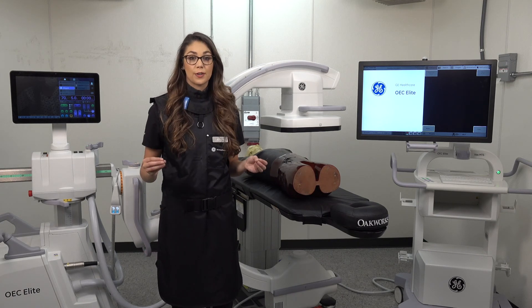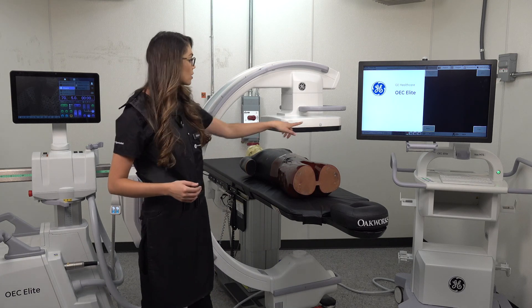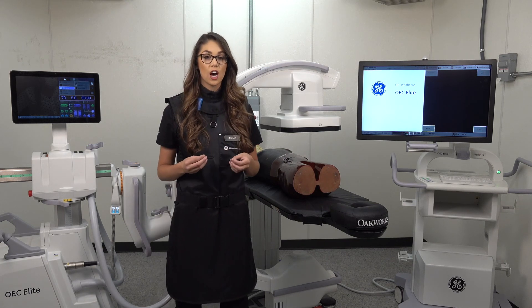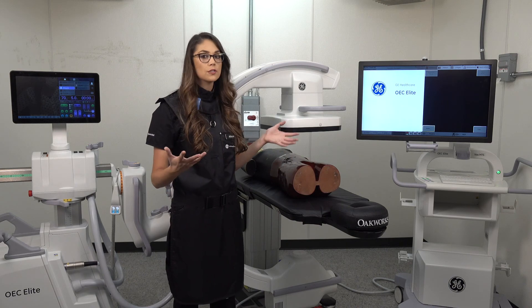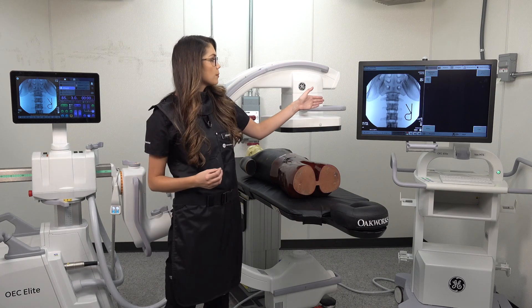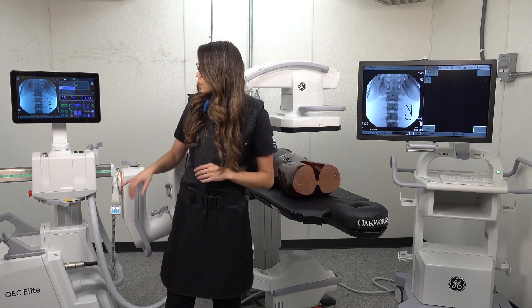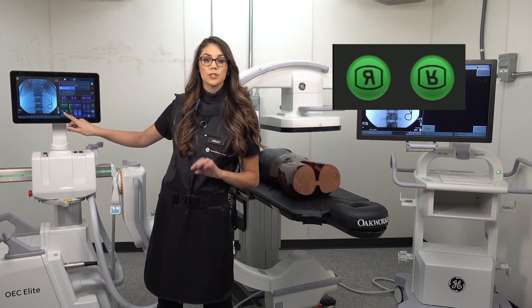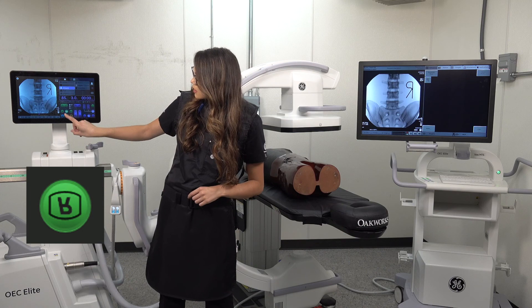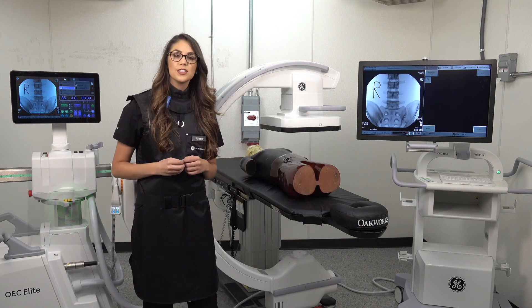Now this is our most difficult patient position. Our patient is now lying supine, but their head is facing away from our smiley face indicator. This is our opportunity to use both of our image orientation options. I'm going to start out by taking our picture just for purposes of this video. You can see that this image is not anatomically correct — we are upside down and backwards. To correct this, I'm going to move over to our touch control panel. You have two options: flipping left to right and flipping head to foot. I'm going to start with the head to foot option, and then one more time we're going to flip left to right. And now your image should be anatomically correct.